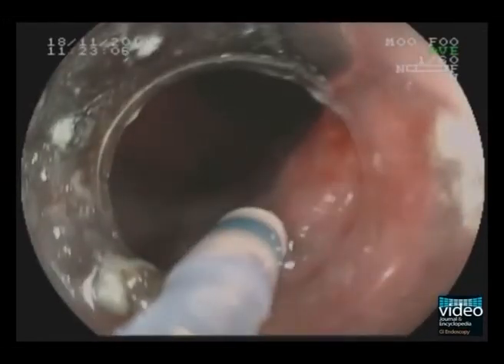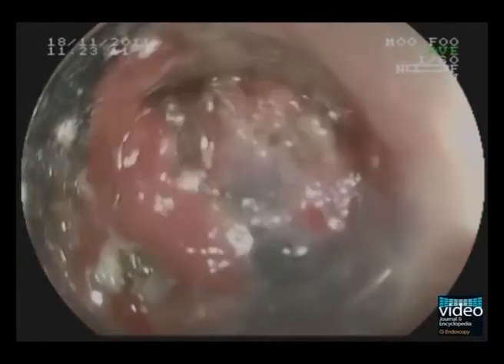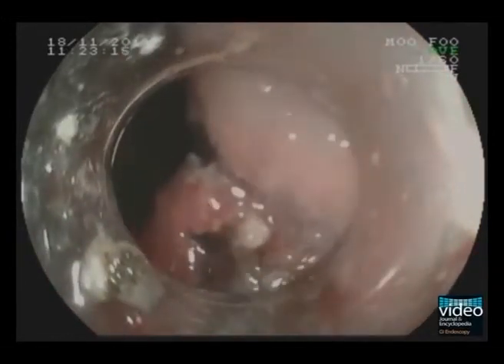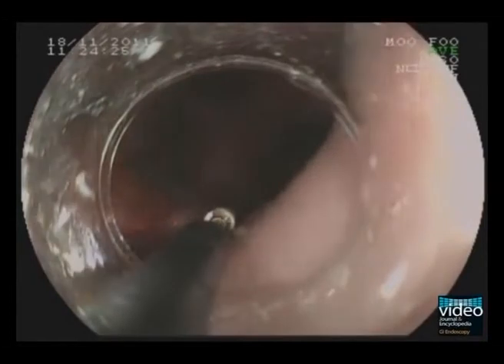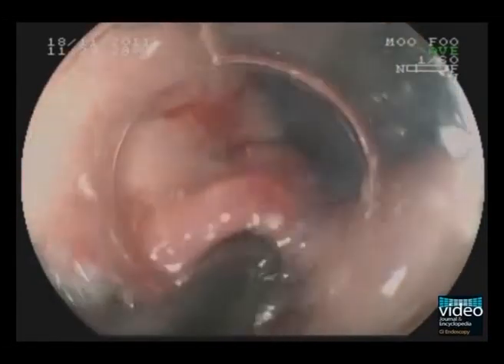Sometimes it can be useful to try a different knife when we find difficulties in completing the cutting. Here we switch to the IT knife nano. This is a type of knife that has been recently developed for use in the esophagus and the colon, but in this case it is a helpful device to complete the cutting on the folds.